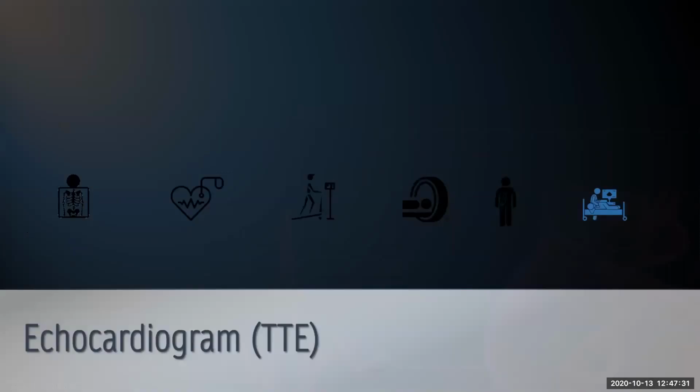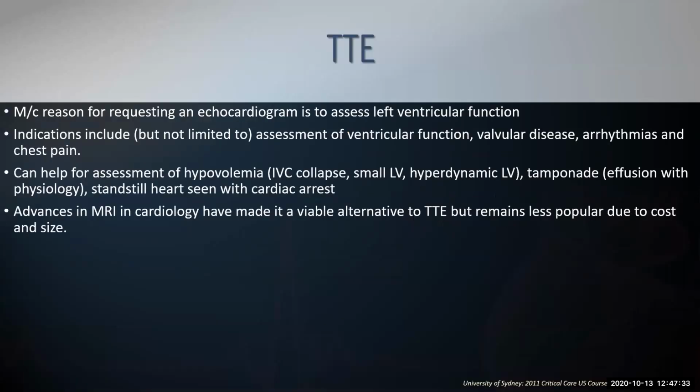And then let's go over to the echo. This is clearly something that Dr. Duffy is more of an expert with than myself or some of the other staff, but I hope I do it justice. The most common reason why we get an echo is looking at the left ventricular function. We can do it in a fast modality, whether we're doing it in the ER in a trauma situation, or we can do it on rounds like Dr. Duffy does as well to see more about what's going on with that patient specifically, or we can just order it and have the cardiologist do it.